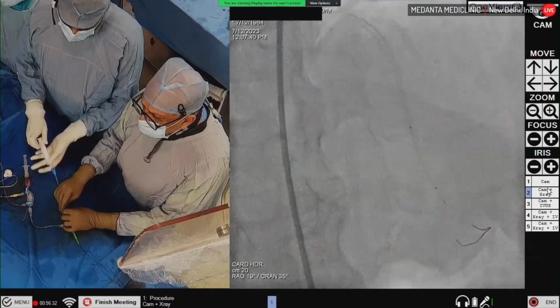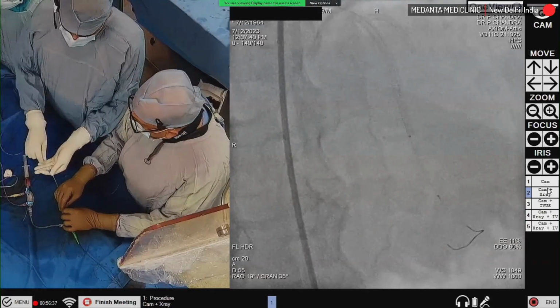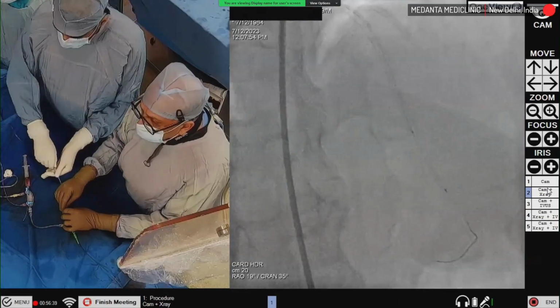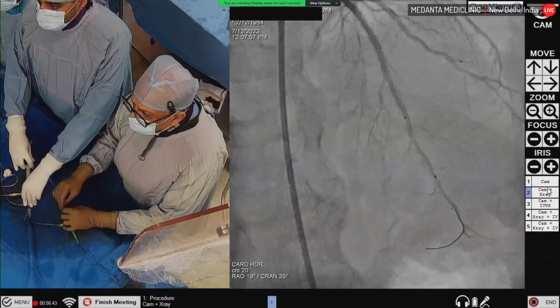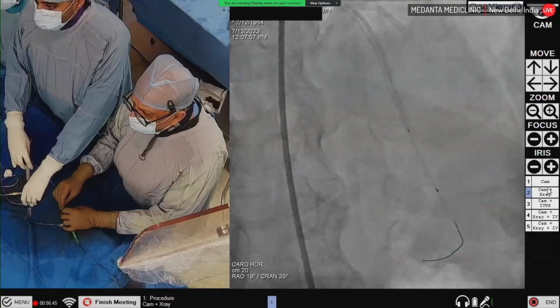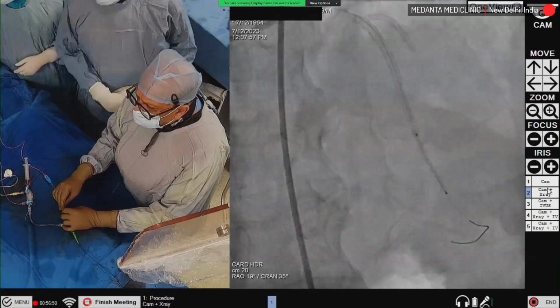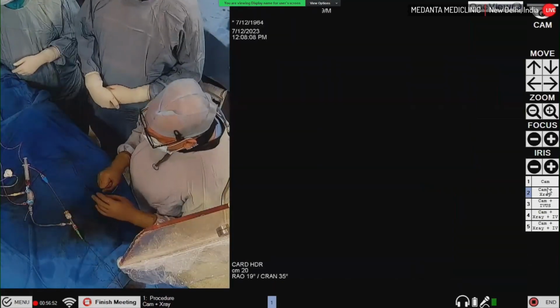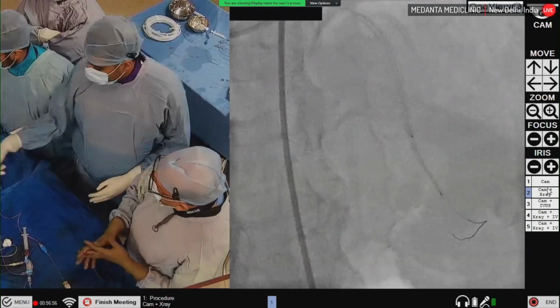Yeah, so here you can see this comes in quite easily, and is going to connect it. Okay, check please. Yeah, this is perfect. Okay, go up. 1, 2, 3, 4, 5, 6, 7, 8. Okay, so what's the size at 8?